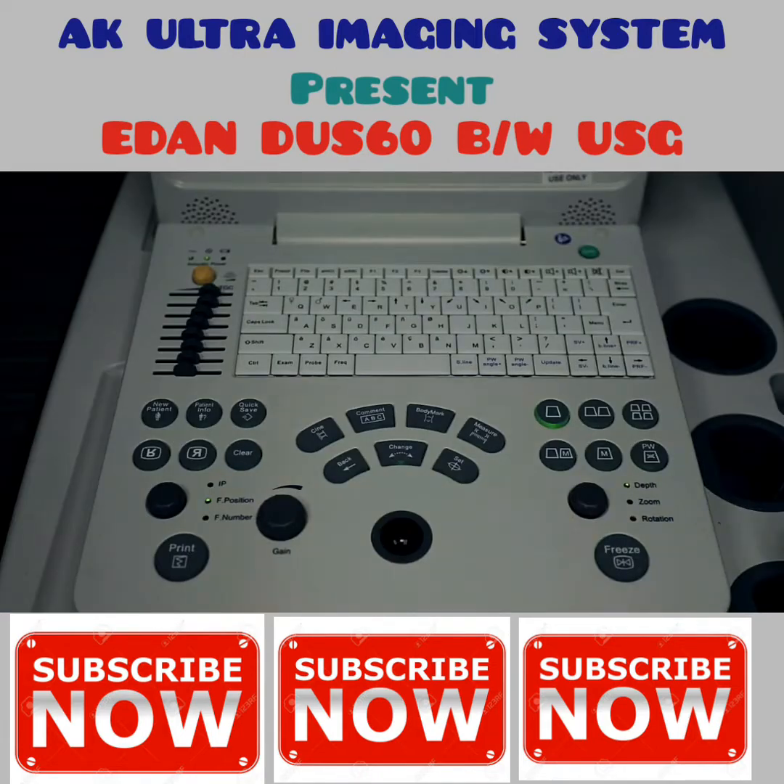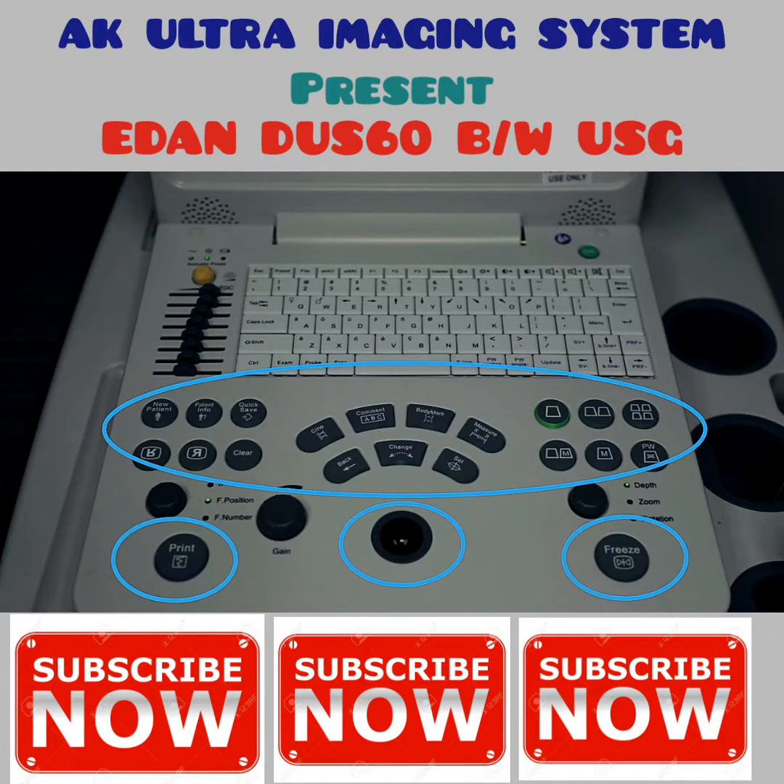The control panel is divided into several sections: keyboard, parameters, functions, and controls.